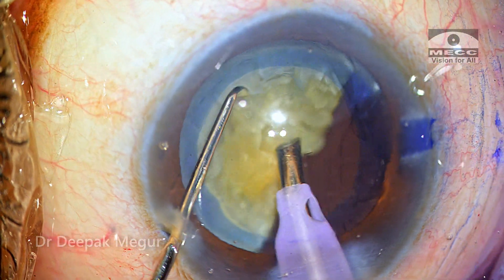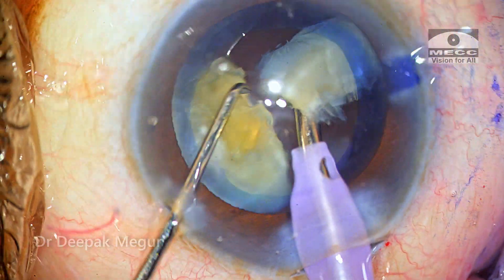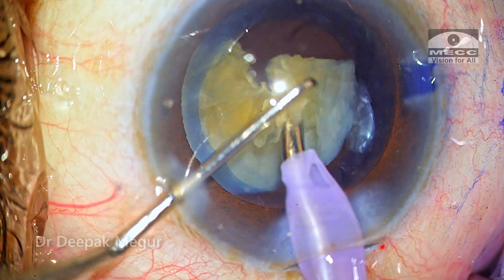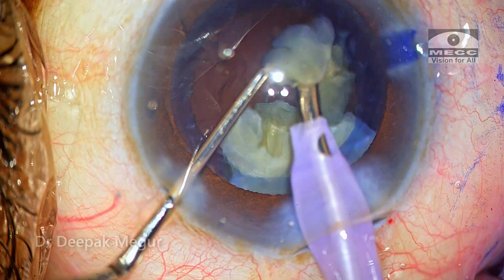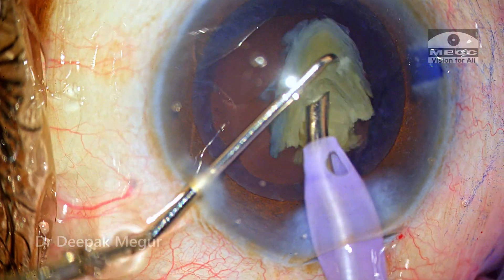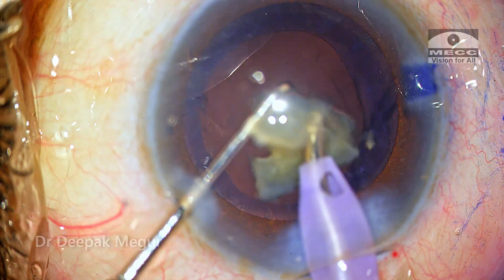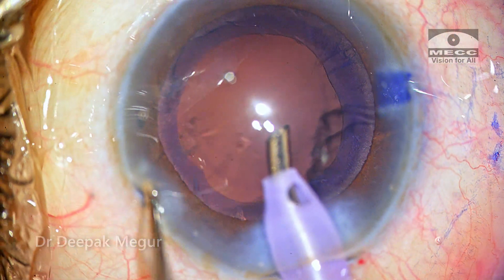Now it's time to deal with the remaining hemi-nucleus. It is held and divided into smaller fragments, and each fragment is consumed individually. As we approach the last fragments, it's important to slow down because the bag will be flimsy and we may be working more anteriorly. The second instrument is used as a shield so fragments don't jump around and hit the corneal endothelium. The nucleus was emulsified quite easily.